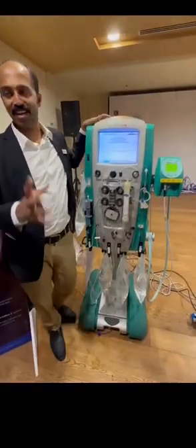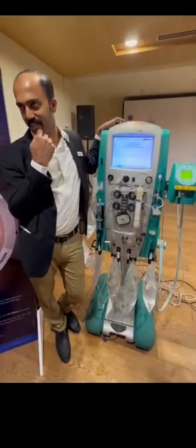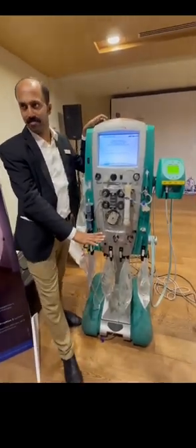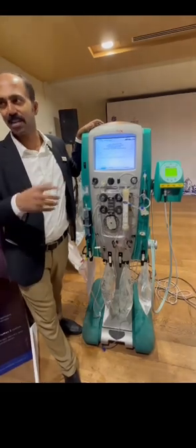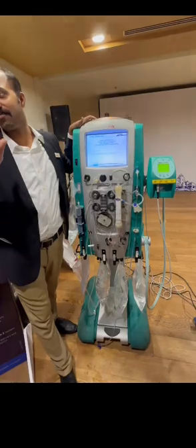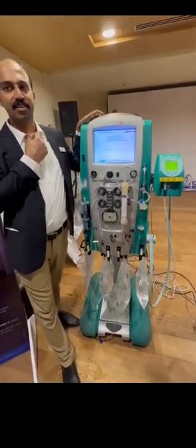We are suggesting giving it externally. Spike it and then give it on. You can add potassium easily, but not in the Prismaflex. But phosphate, bicarb, all these things, it is better to give. But we have options. Somewhere I am doing that also. Add bicarb first. That is available here, but in most other countries it is not available.